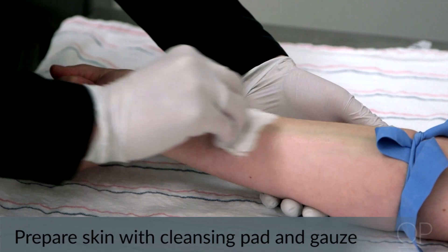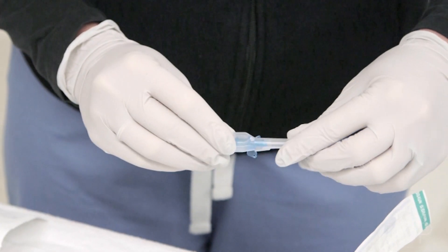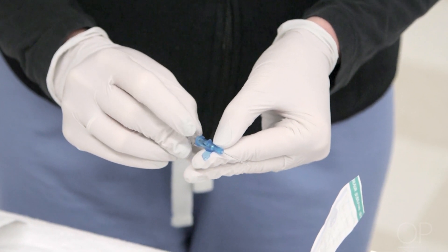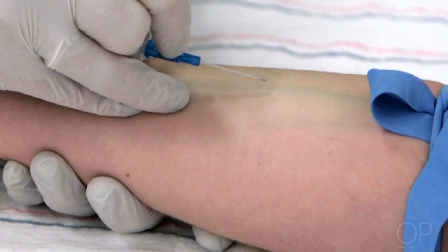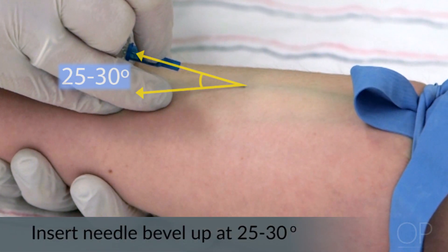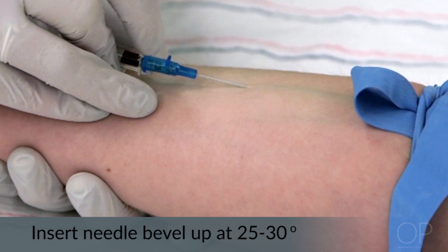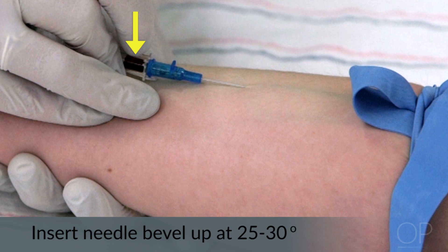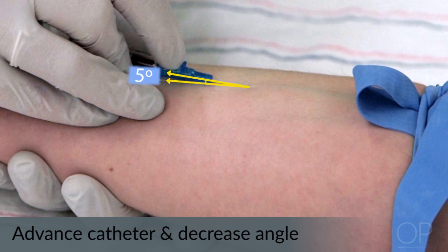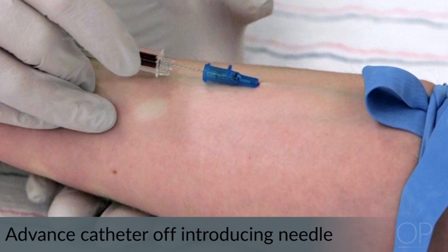Prep the skin using your cleansing prep pad and gauze, and let the area dry for approximately 30 seconds. Remove the plastic covering from the IV catheter, exposing the needle and cannula. Loosen the catheter from the needle. Hold the IV catheter with the bevel of the needle facing up, and puncture the skin at a 25 to 30 degree angle to access the vein. Insert the IV slowly to avoid going through the vessel. Look for a flashback of blood in the catheter as an indication that the IV is in the vessel. Once flashback is visualized, advance the catheter slightly and decrease the angle to be more parallel with the skin.